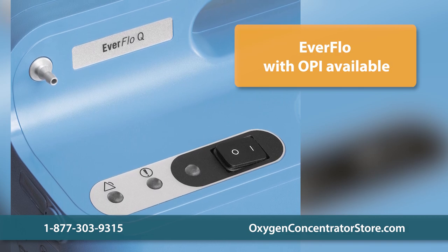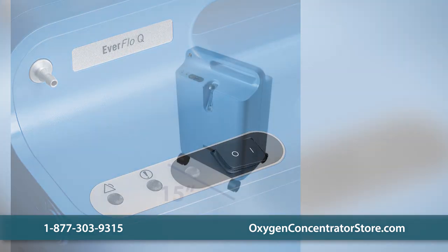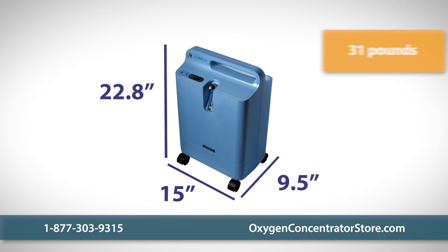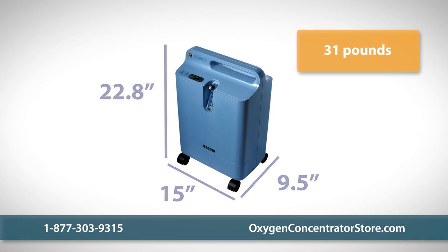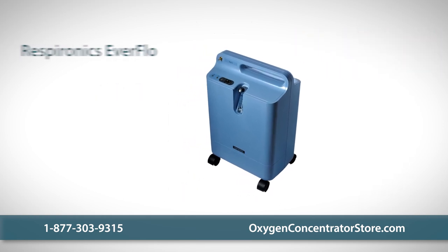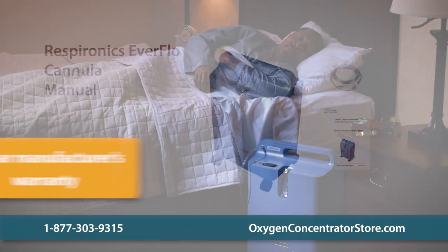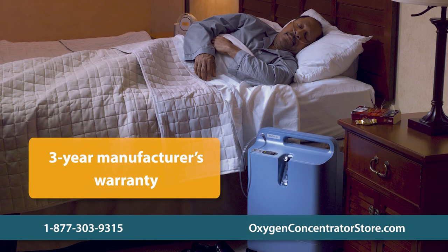Both units measure 15 inches wide, 9.5 inches long, and 22.8 inches high, and weigh 31 pounds. Your purchase includes the Everflow unit, a cannula, and a user's manual. We also offer a three-year manufacturer's warranty on the unit.